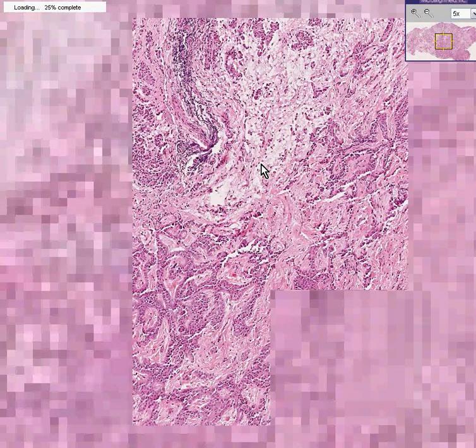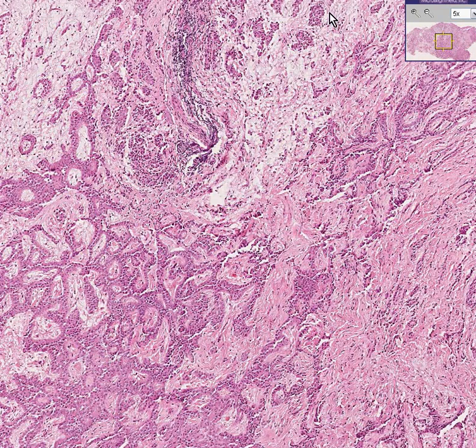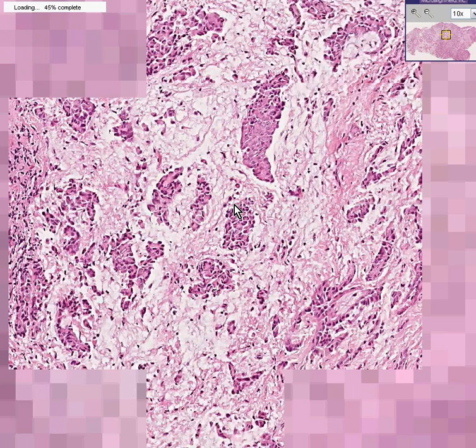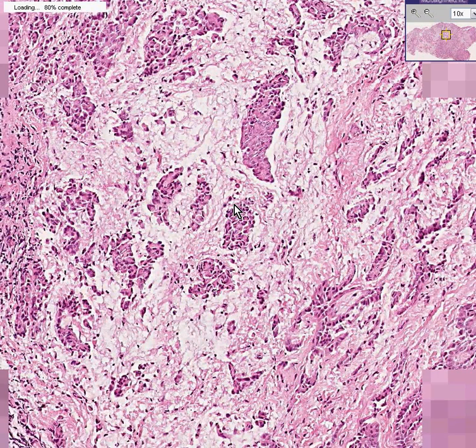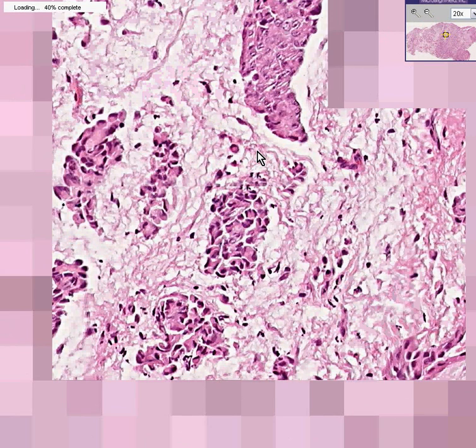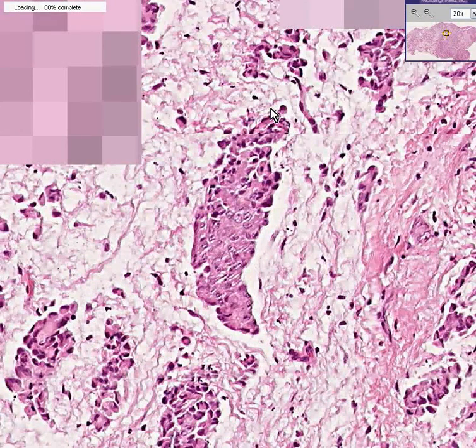And I know what you're thinking. You're thinking, my God, how the hell am I ever going to tell that these are mesothelial cells in all honesty rather than squamous cells or poorly differentiated adenocarcinoma? Well, to tell you the truth, microscopically you often can't, and you would have to do a battery of stains to differentiate these cells as having a primary mesothelial origin rather than an epithelial origin like you see with squamous cells or adenos. Because quite frankly, on a good day or on a bad day, if you showed this to a pathologist, he could very easily call it metastatic squamous cell, but he'd be wrong, but he'd still be smart.